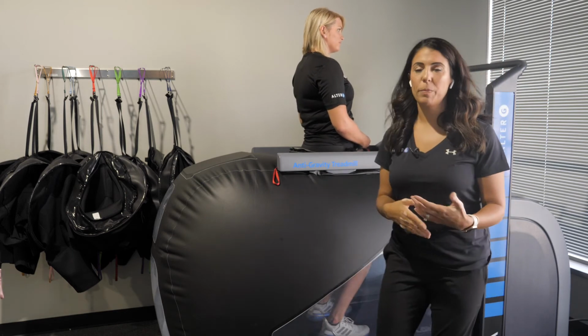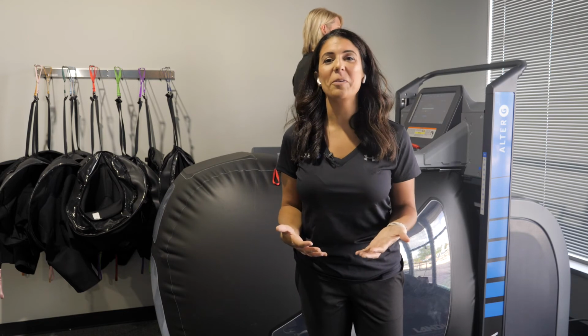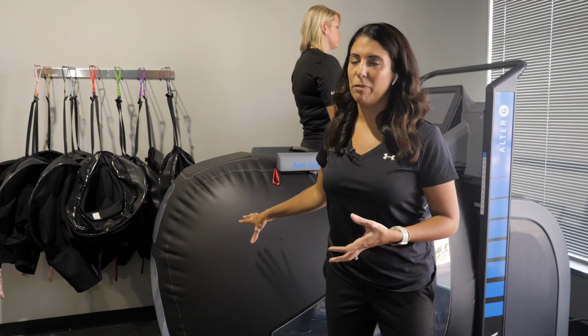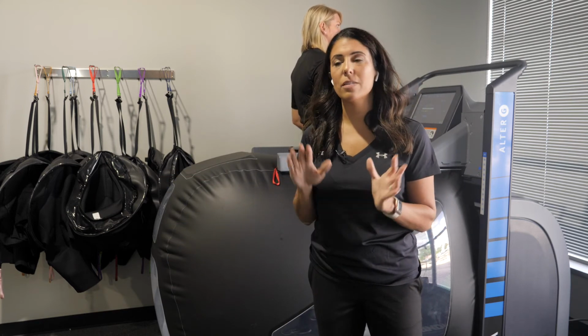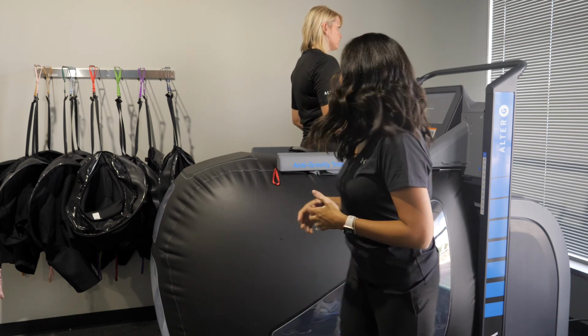So it's a great way if your patient has overexerted themselves a little bit. You have them walking, they're walking without pain, they're loving it, so they're walking longer than they typically do, but they might need a little bit of a break before they have to get out of the bag. This is one thing you can do, just press pause, bump up the body weight support, and let them give their legs a little bit of a break.